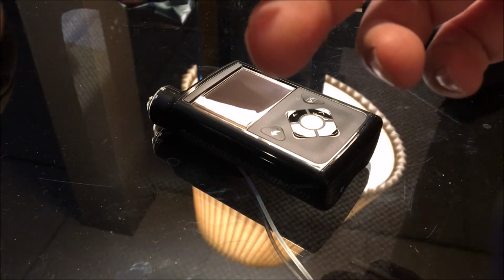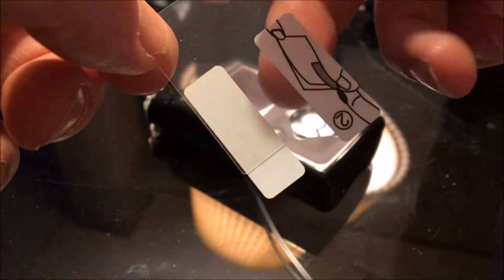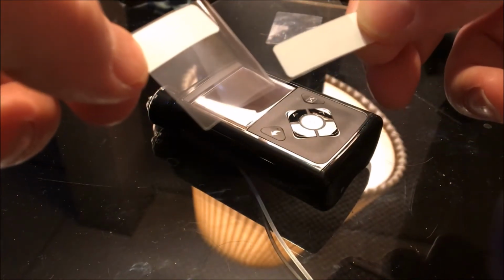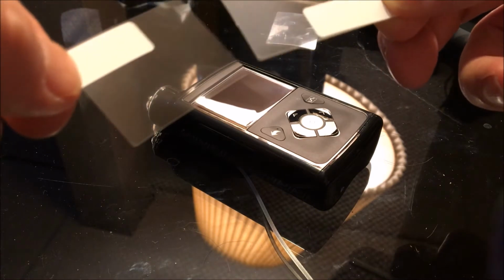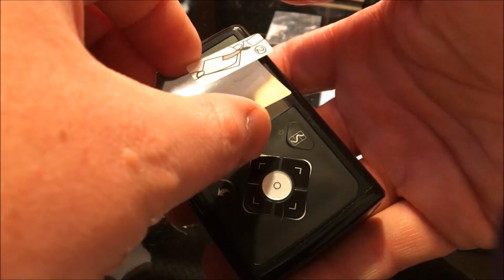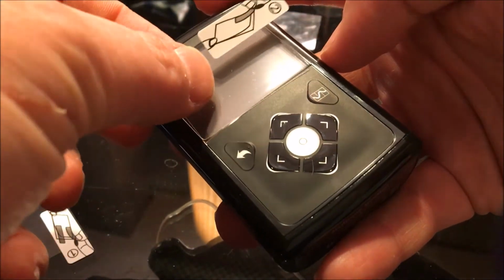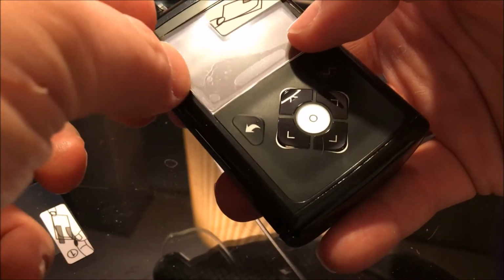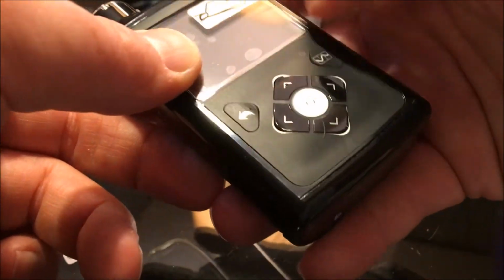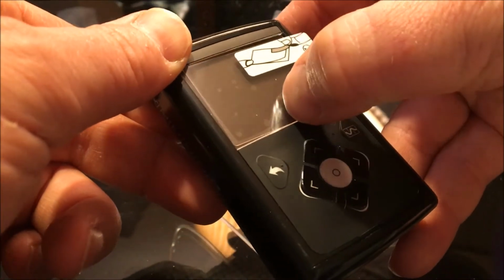Okay, so one is marked there, and then 2 is marked there. So what I think it applies to do is to pull these 2 apart, and then you're like, okay, we got a screen protector, right? So I think then we put this down carefully over the screen there. And I'm pushing it down. Yeah, there's a lot less bubbles than there was last time. See if I can work them out with my fingernails.